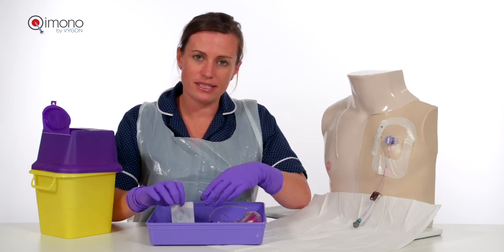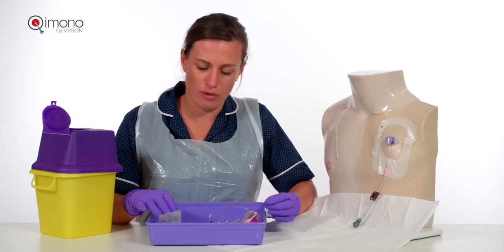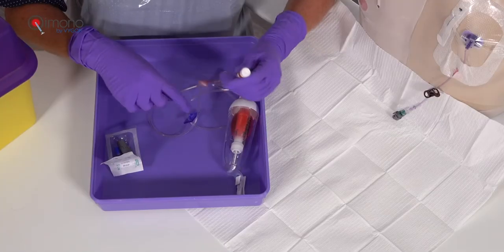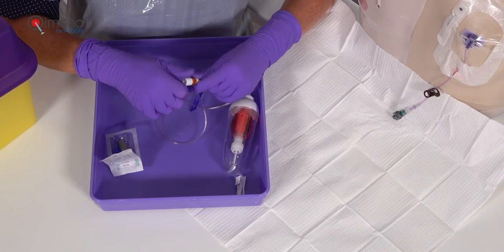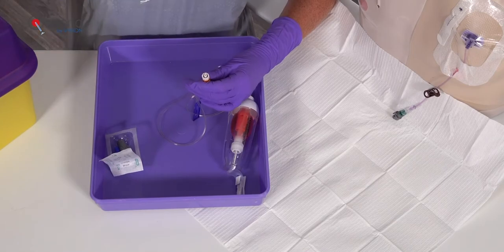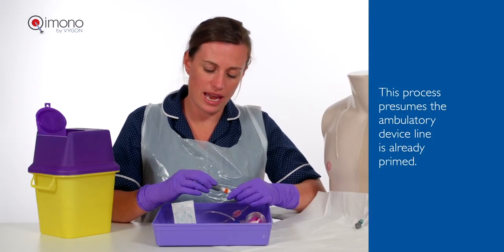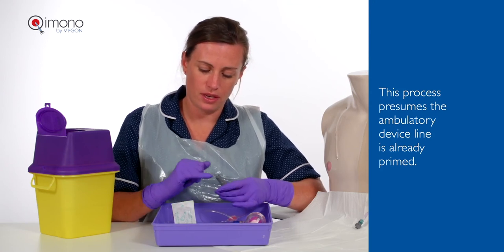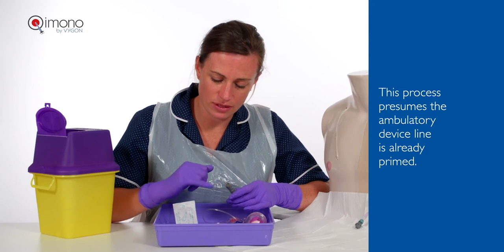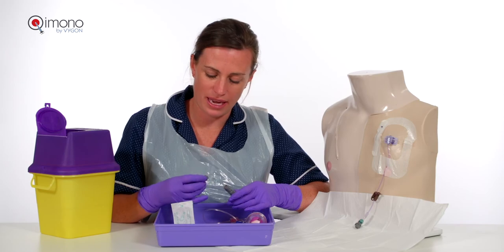For safety reasons, once these devices are connected, they cannot be removed. The line is clamped and the cap is removed. Connect the Chemo Mail onto the end of the luer connection, not contaminating the end of the device. This does not need cleaning again because it's fresh out of the packet.